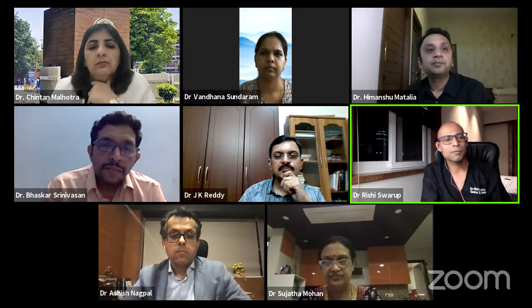You're incidentally seeing that the treatment was done, especially in higher myopes where people had reduced the optical zone. You do find that they're not complaining. They are complaining about refractive error only. Yeah, but your refractive correction will be very unpredictable. So I agree. I would rather just tell them that you have this problem. I'll show them the map, and I will tell them that, like Ashish said, counseling would be the most important. Your chair time is going to increase, and I think that's the important part for them to understand this.